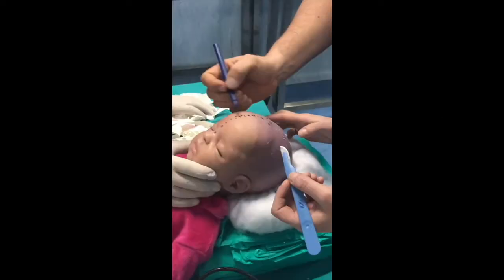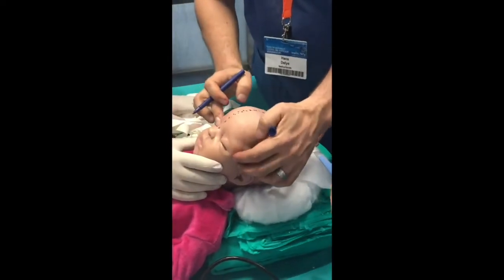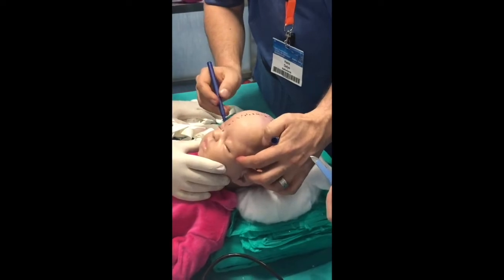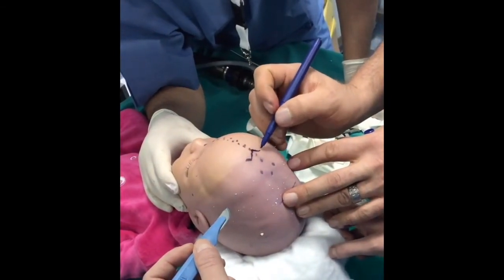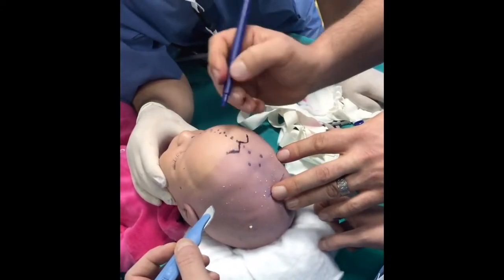Metopic approach. Demonstration of placement and skin incision. The model is placed in supine position. The skin incision is drawn as low as possible, just behind the hairline, which is sometimes difficult to establish in small babies. A double U-shaped skin incision will allow a safe subgaleal dissection and bone resection.